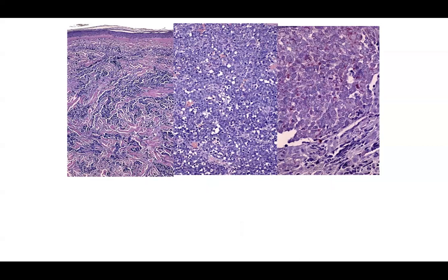Moving on — do you think this is neoplasm or inflammatory? On the left, the lymphoid population appears to be dissecting through collagen bundles, suggesting a possible interstitial growth pattern neoplasm. The middle and right panels show enlarged epithelioid cells with speckled chromatin, molding together — a big blue tumor. What's your differential, and which immunohistochemical stain would you use?